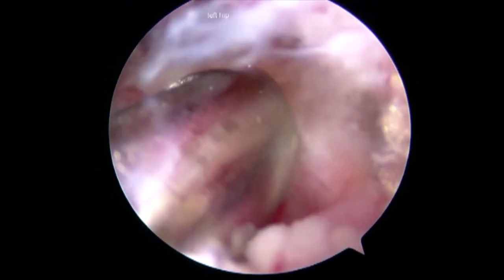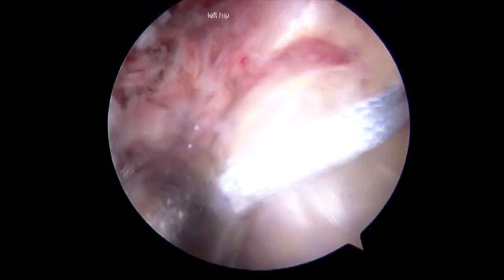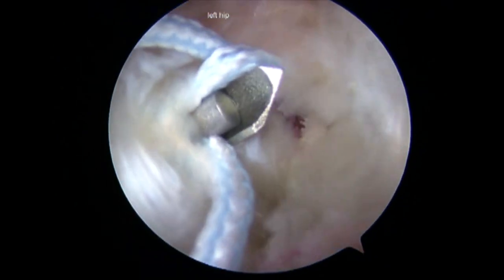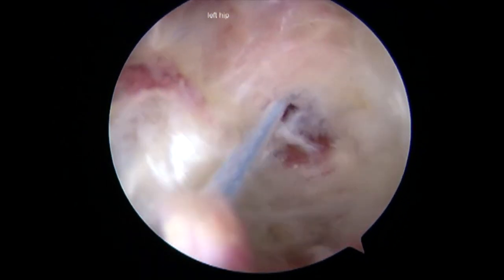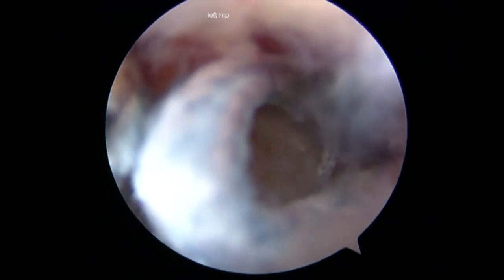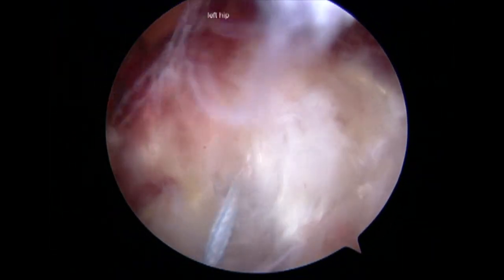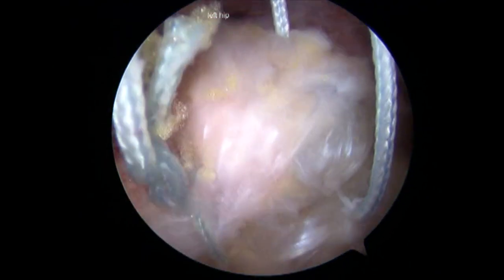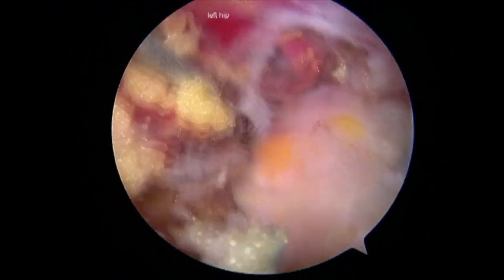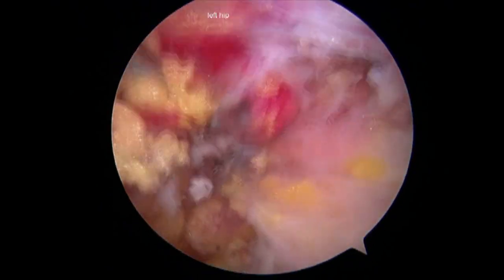Another anchor was then inserted for further repair and fixation of the delaminated tissue. A self-retrieving suture lasso device was used to pass a suture through each leaflet for a mattress-type repair. A knot pusher was used to push the knot down to the tendon. We then probed the repair to assess if further anchors were needed and noted strong fixation at this time.